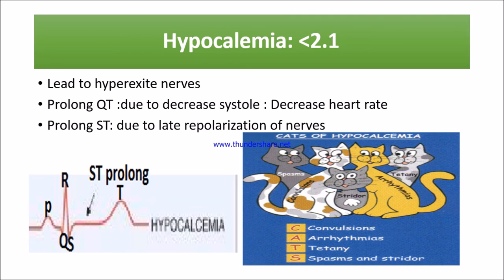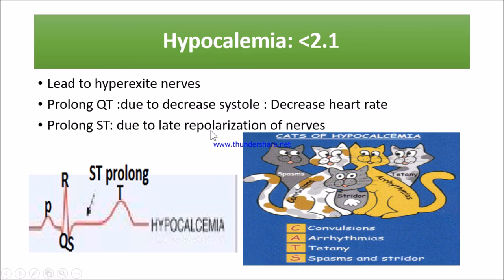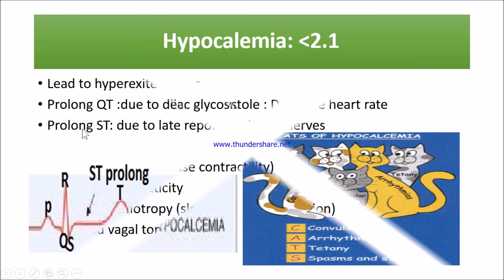There is a prolonged QT interval and prolonged or horizontal ST depression. The prolonged ST is due to late repolarization of the nerves. The ST segment always denotes ventricular repolarization, and because of decreased calcium, repolarization is also affected, resulting in prolonged ST.